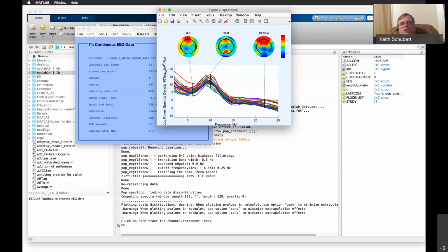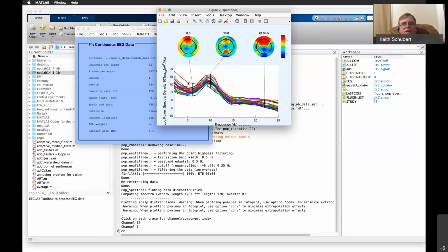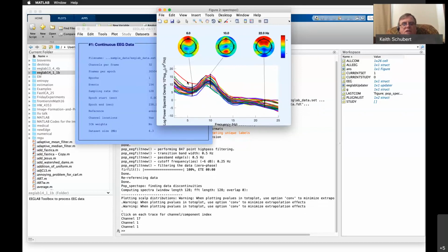The reason why we show these is we want to see, does it look reasonable? We're looking for that reasonable intuition. Okay, alpha waves handling that, where it goes. The planning being more in the beta wave zone. Okay, that again makes sense. We do see a little bit of outliers, these two here, the red and the blue. That's another thing we can do. And you can click. When I click on this, it says channel 1.